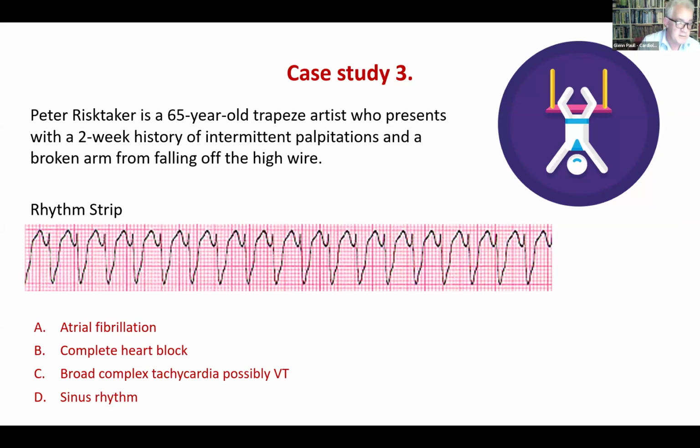The algorithms on the ECG machines sometimes spit out this is sinus rhythm, or this is a heart attack, or this is atrial fibrillation. Normally they have an algorithm called the Glasgow algorithm. That's what they use in a lot of the ECG monitors. And they're fairly accurate, but by no means 100%. I mean, they will be wrong most days that I look at them, but they're worth looking at, but they're not infallible.